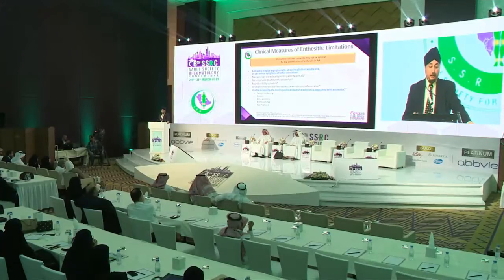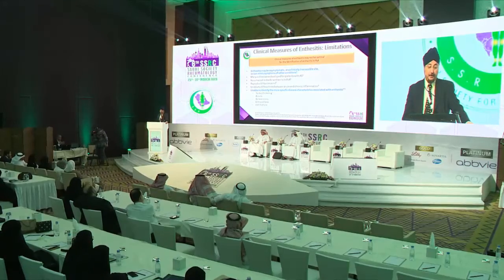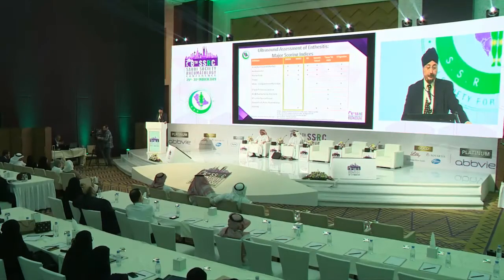So this is where I think we as imagers come in, and we have a lot of interest in seeing what is occurring underneath the skin and trying to identify whether there are patients where you have a discrepancy between pain and enthesitis, and we'll talk about that in a second.